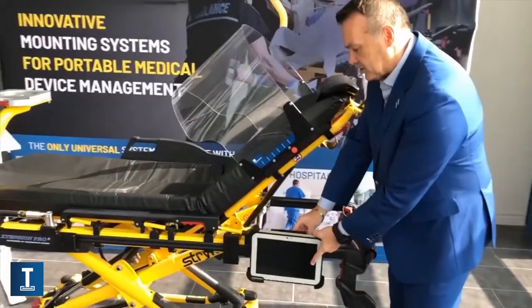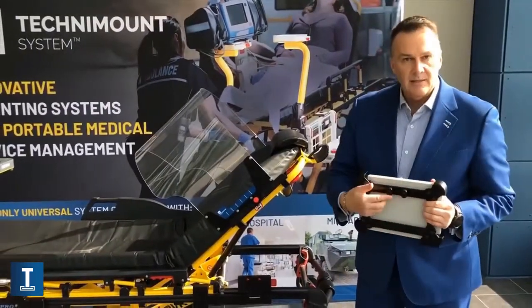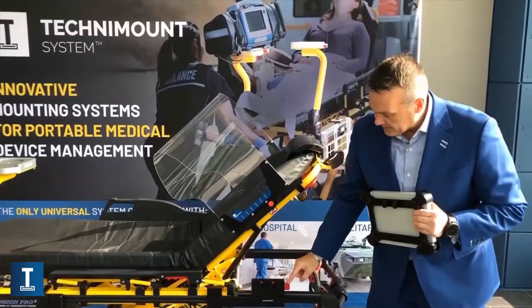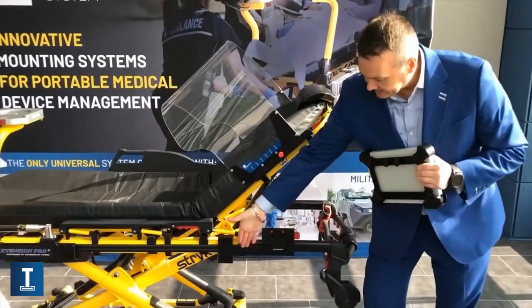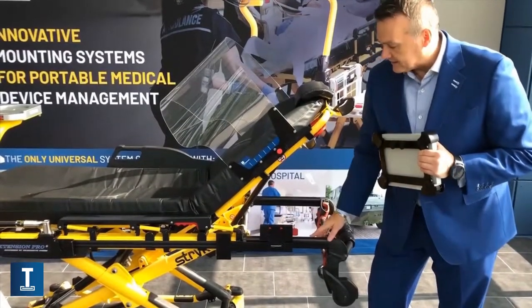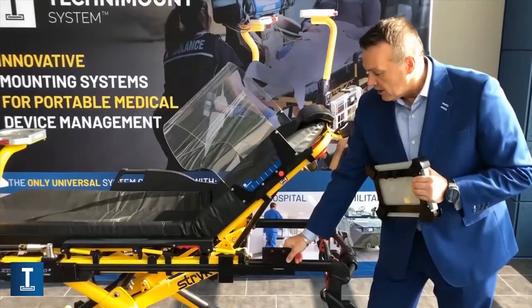You have a locking mechanism — you just push and it raises up. As you can see, you have pins here that lock into those slots. With the red knobs you can see the mechanism moving away. This is also an expanded version that gives you full access to set it at a 45-degree angle right here.